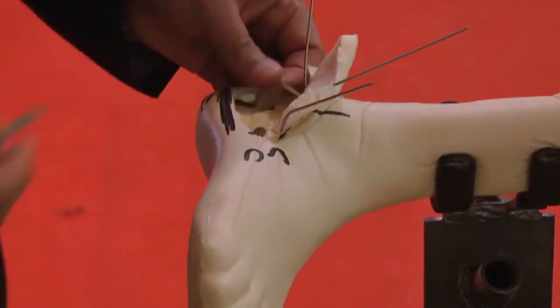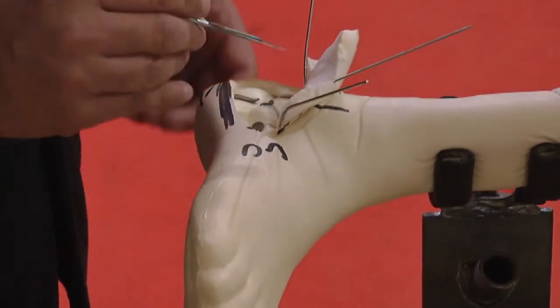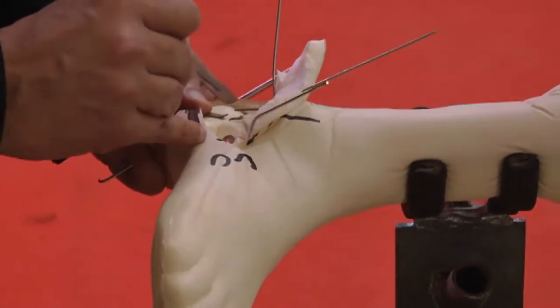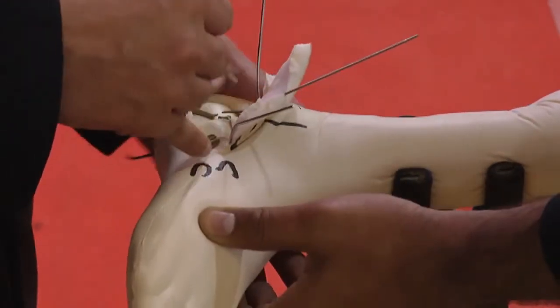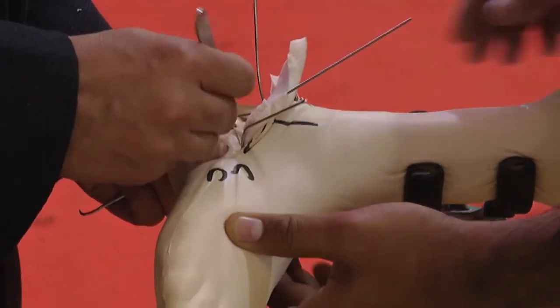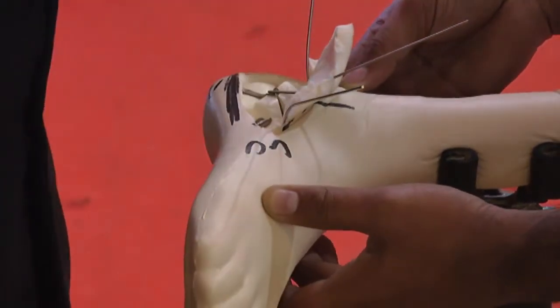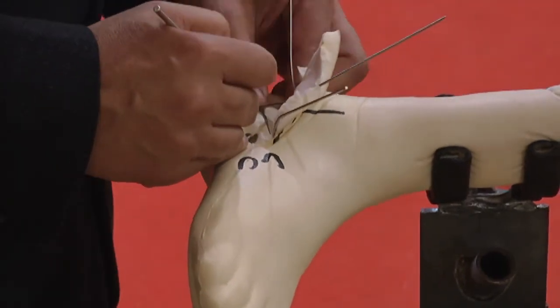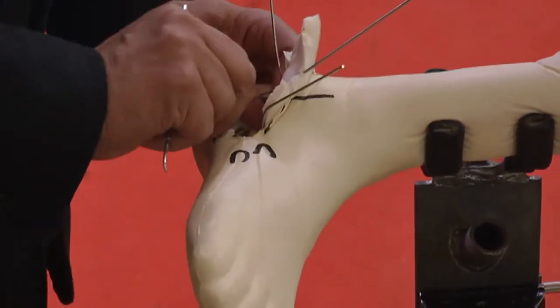I'm going to take out these structures which are here in the bone model, meant only to hold the bone fragments in place. So we don't have a forceps, so I'm going to just cut off these tags of tissue which are here just to hold the bone model. The anatomy generally is that there is a lateral wall blowout, which means the lateral wall of the calcaneus is actually a separate fragment, this one. So here the fragments are very well in place, very nice to fix them. But in real situations, you have everything impacted and displaced.